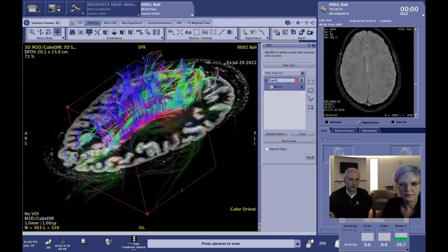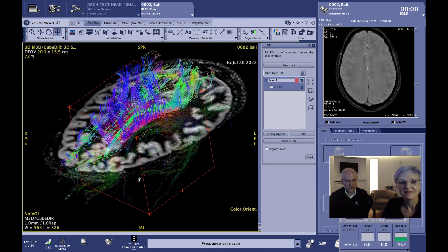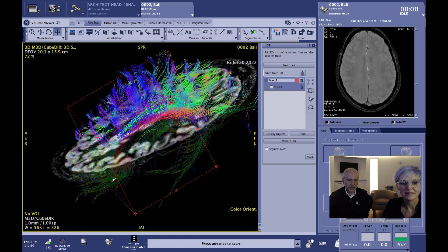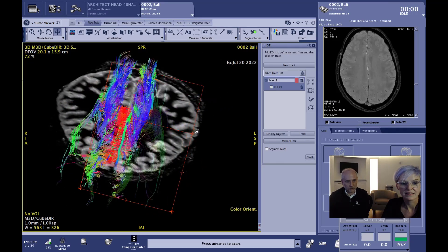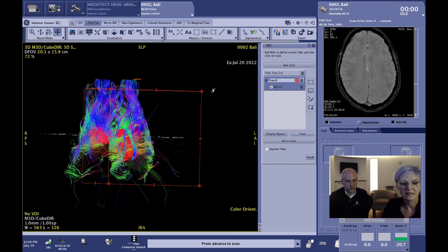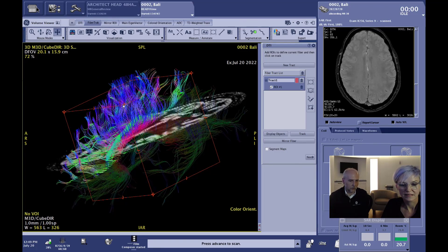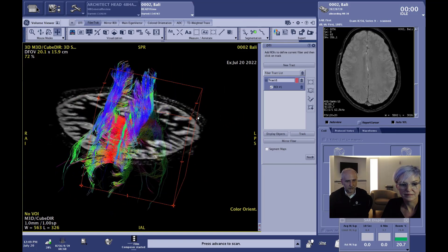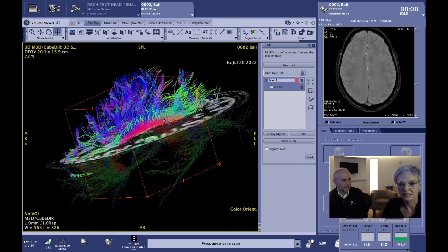The next scan acquired was the diffusion tensor scan — 30 directions, with Hyperband acceleration, completing in approximately 1 minute 30 seconds using Air Recon DL on the DTI. This shows a tractography result fused to the Cube DIR, and the tracks look really nice. As mentioned, this can be used on multi-shell or single-shell DTI acquisitions. Air Recon DL is a really valuable addition to diffusion tensor imaging, yielding great results.